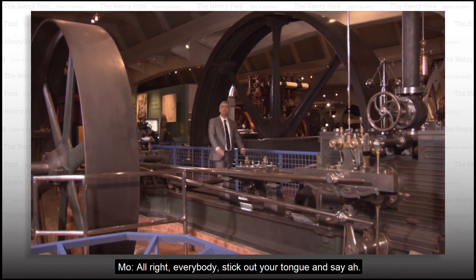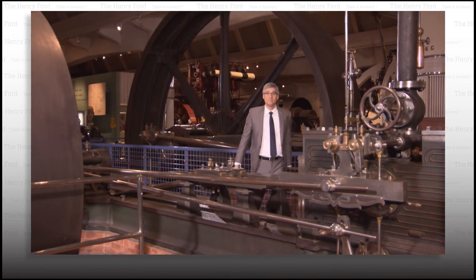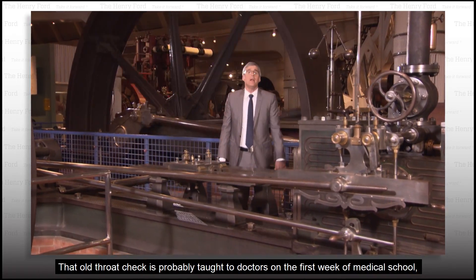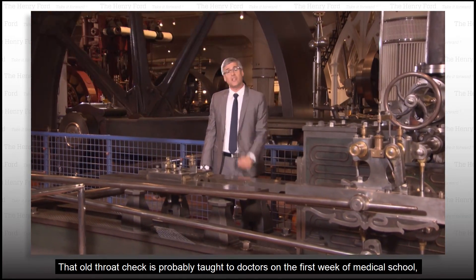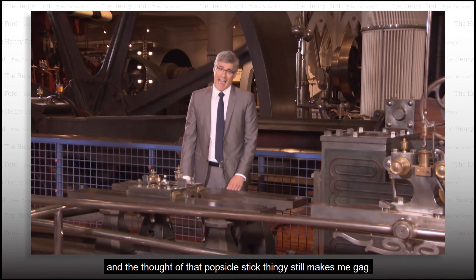All right, everybody, stick out your tongue and say ah. Okay, now close your mouth — you look a little silly doing that to a TV. That old throat check is probably taught to doctors in the first week of medical school, and the thought of that popsicle stick thingy still makes me gag.